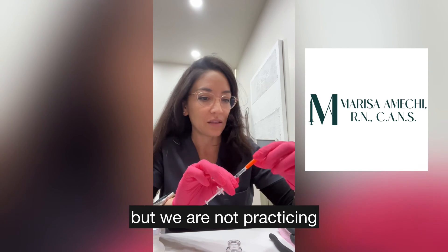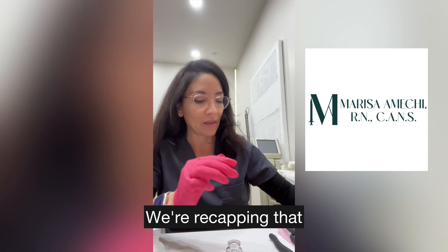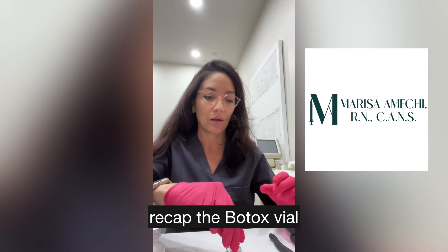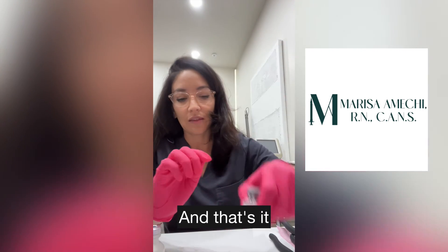Nursing 101 says we're not supposed to recap, but we are not practicing what we're preaching — we're recapping the syringe. Then you're going to carefully recap the Botox vial, and that's it.